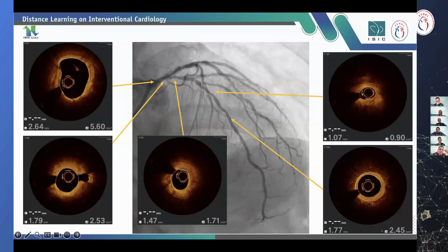Okay, thank you very much. How about Professor Saifur Rohman? Would you use a two-stent strategy, considering there is a huge plaque burden at the ostial circumflex despite a normal functional test, or would you just do provisional stenting to the left main LAD? And how would you do the two-stenting from the left main LAD?